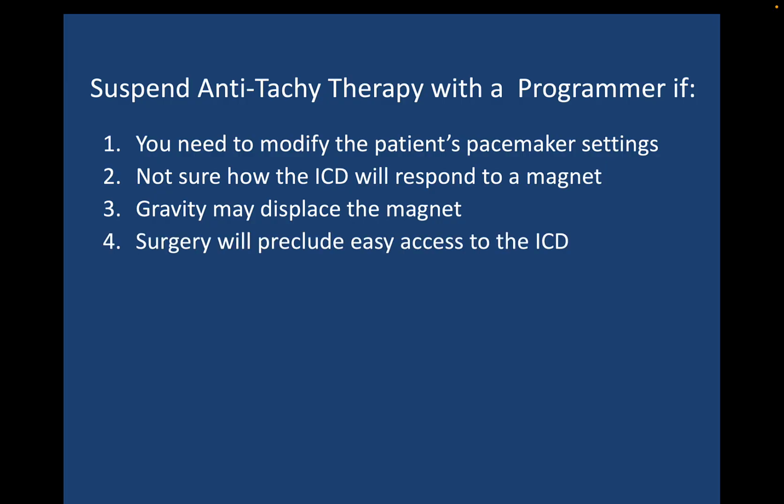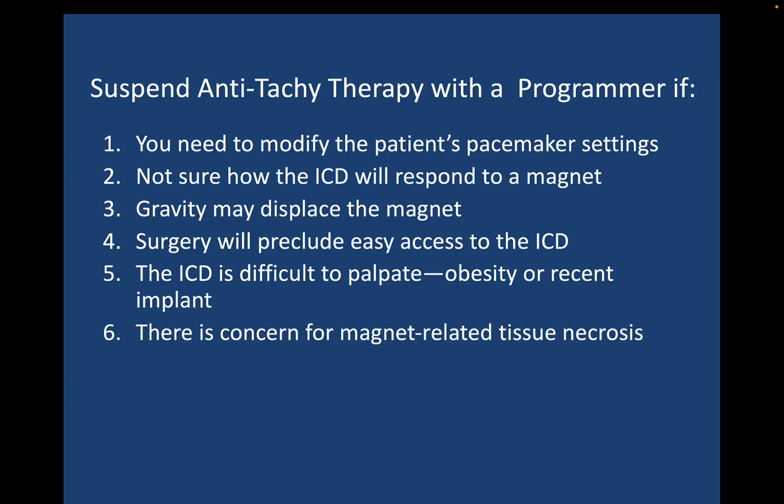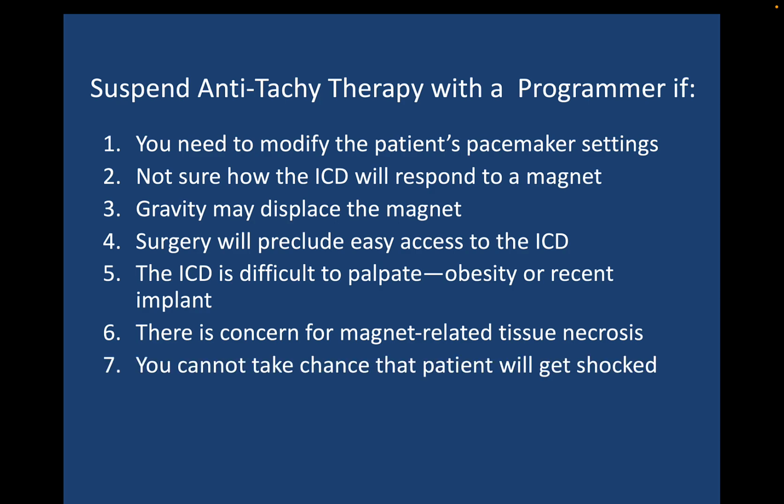If surgery will preclude easy access to the ICD, such as thyroid surgery or heart surgery, I would suggest a programmer. If the ICD is difficult to palpate, patient's obese, or there's a recent implant so they have a dressing on it, your magnet's not going to be reliably in position, use a programmer to turn off the anti-tachytherapy. If there's concern for magnet-related tissue necrosis in a really frail old patient, use a programmer. And then lastly, if you just cannot take a chance that the patient will get shocked, the patient's having a very delicate procedure, the patient's going to be wide awake, whatever.